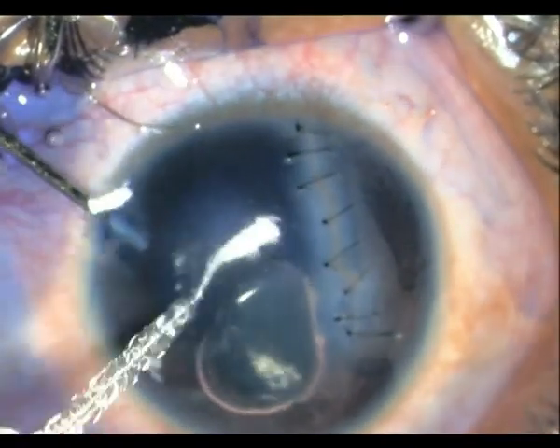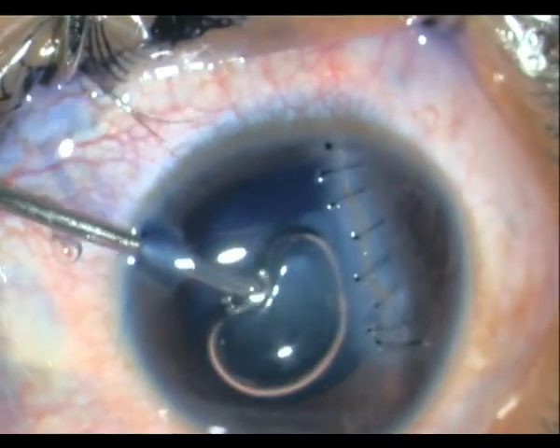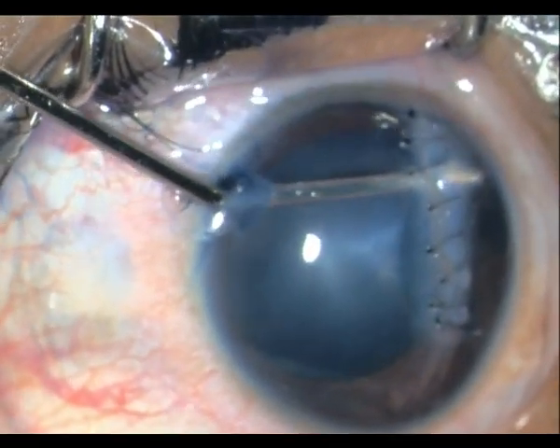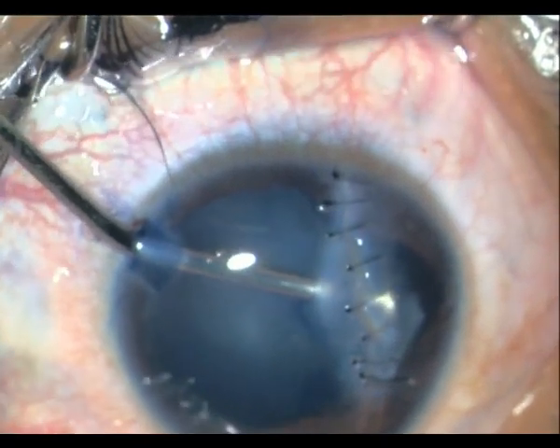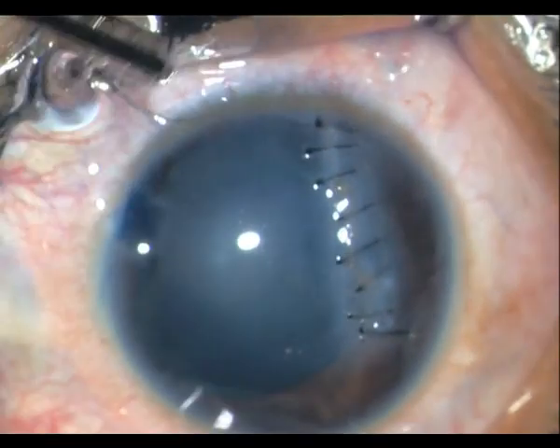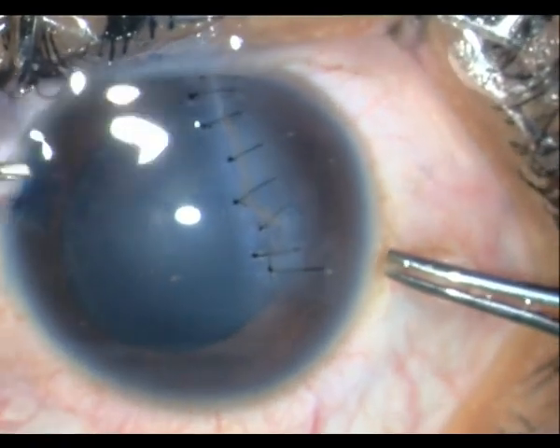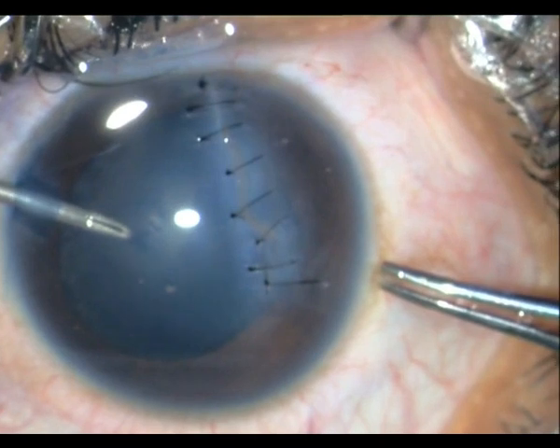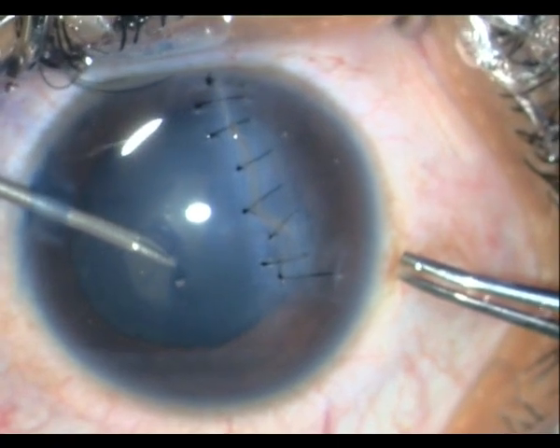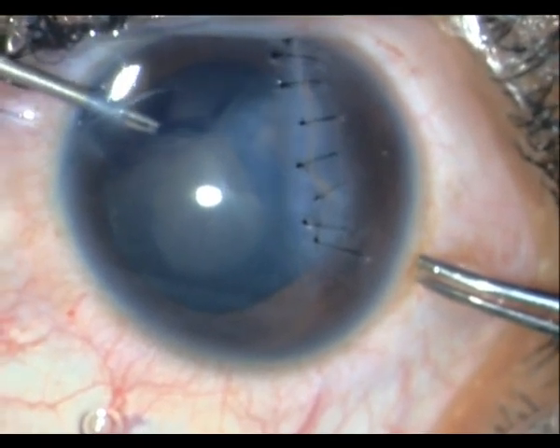I then wash off the trypan blue and express the air bubble with HPMC, filling the chamber with HPMC. I do a little blunt dissection on the other side to try and separate the iris from the wound. Now in the intact capsule, I am fashioning a capsulorhexis with the help of a cystitome and a pediatric rhexis forceps. As you can see, there is a tear on the other side, so you have to be a little careful.